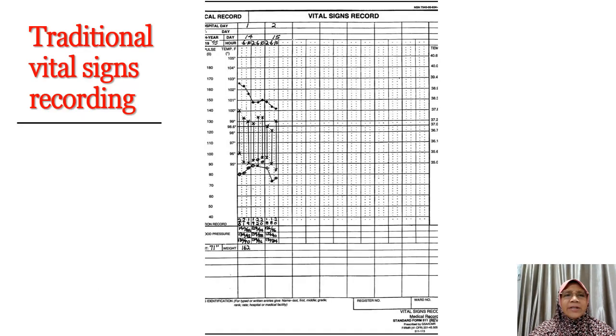Okay, this is the traditional vital signs recording where medical doctors normally use a paper chart, and they have to fill in the paper chart manually by handwriting.